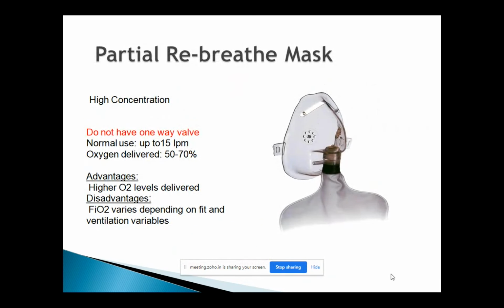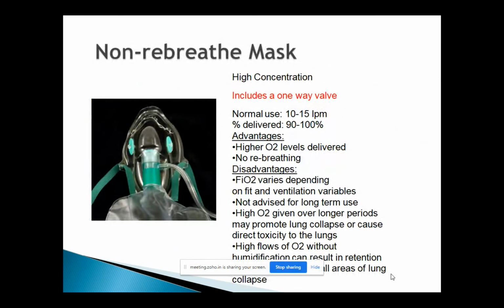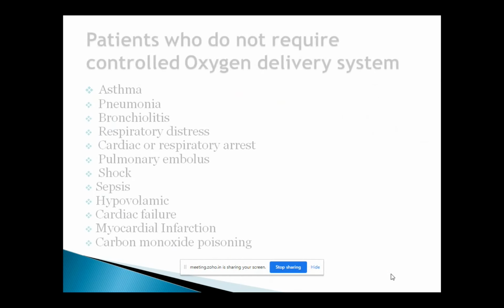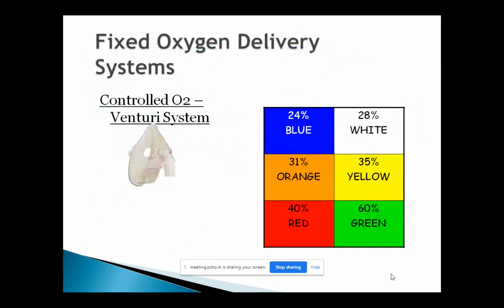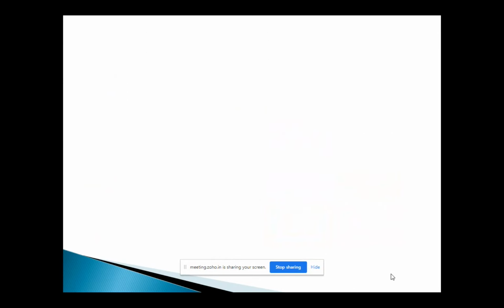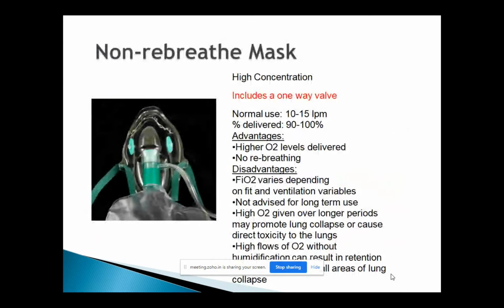In between this device and this device, the common mistake I've seen is when the patient must be improving, what they do is they try to wean the patient from the oxygen. They end up reducing the oxygen flow from 10 liters to 8 liters, 6 liters, and 5 liters. Remember, I said this mask is a very, very good mask if you're aiming to achieve high oxygen concentration.